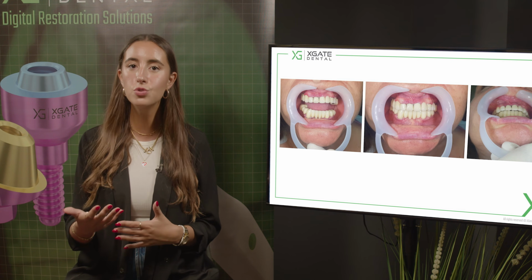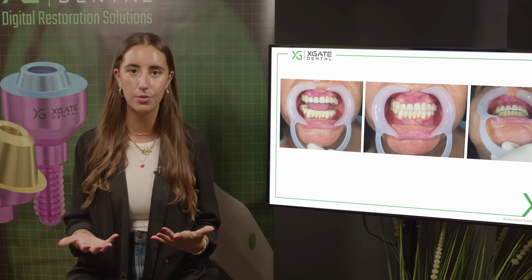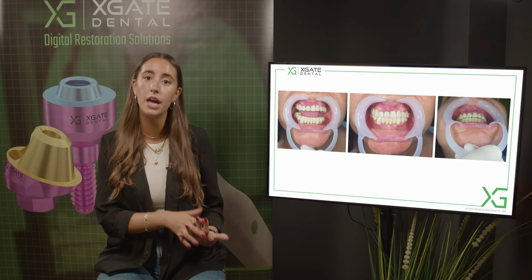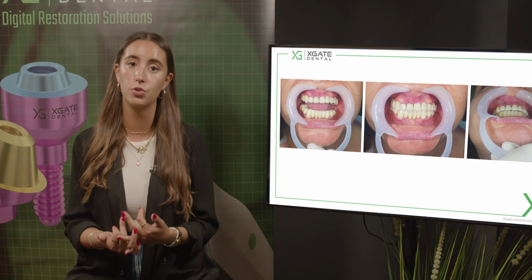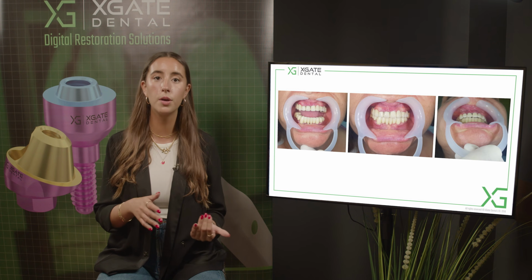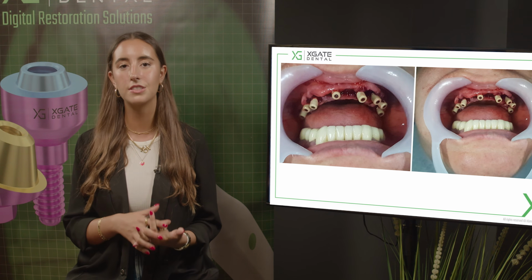She also got used to those relations. She had these bridges for a long time. She wanted to stay with them. We just need to extract the teeth and change the bridges to new bridges, and we want the new bridges to be in the same relations. So this way, it's much simpler for the doctor to do it on one bridge at a time and not everything all at once.